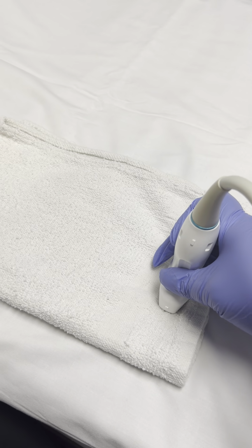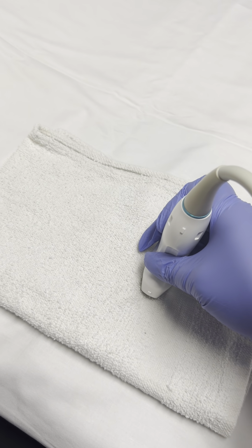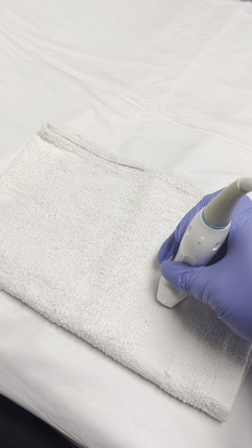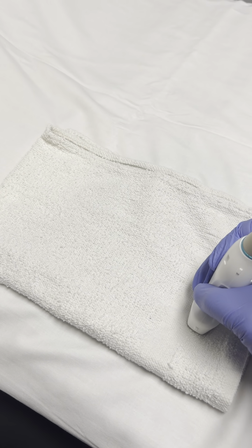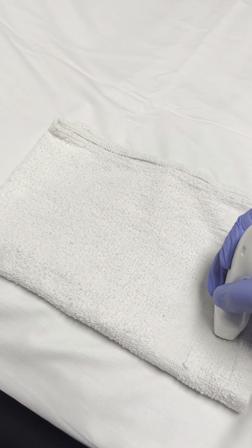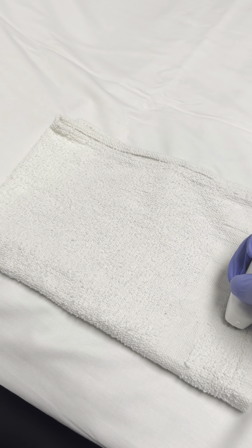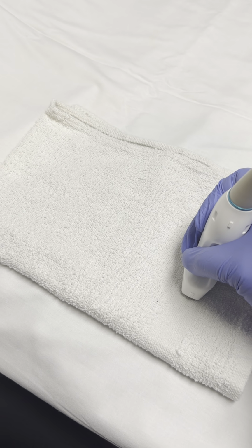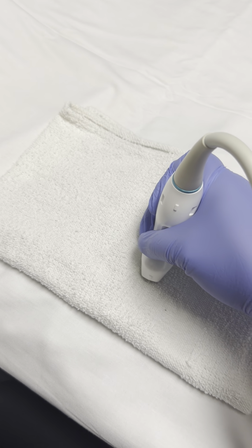This is how my probe is. You see my marker. And then I scan up into the chest wall of the baby or fetus. Because we know that the head is down, we assume the left sided structures are clockwise. We're already at a 90-degree rotation, and so it's all about moving upward. So we move into the chest. We'll see the heart, and then stomach.